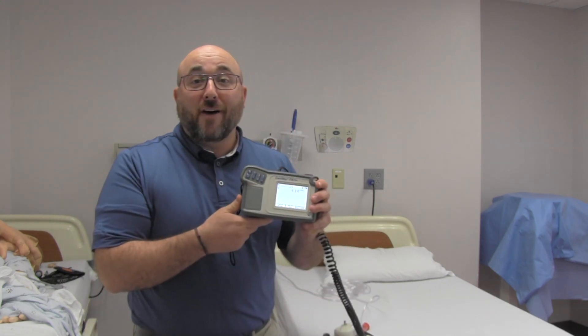Welcome back to the RT Clinic. Today I'm going to try to prove or disprove something I've been hearing from patients for years: that the longer the oxygen tubing is, the higher you have to turn the oxygen flow up because it won't get to the end. I'm tired of hearing it — I'm going to prove it with a little device I have.